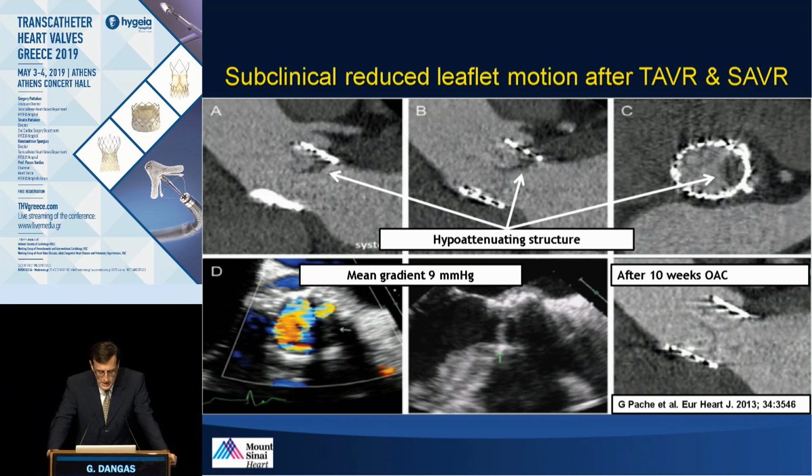No matter how great this image can be, you can realize that this is a subtle finding, because if this is the best image from a very top imaging center, you can see artifacts blooming from the stent and various other factors relating to the imaging protocol. In non-centers of excellence, run-of-the-mill, regular CTA scanners in radiology departments in hospitals around the world cannot produce these images very clearly. Hence, it's also a small and subtle finding.